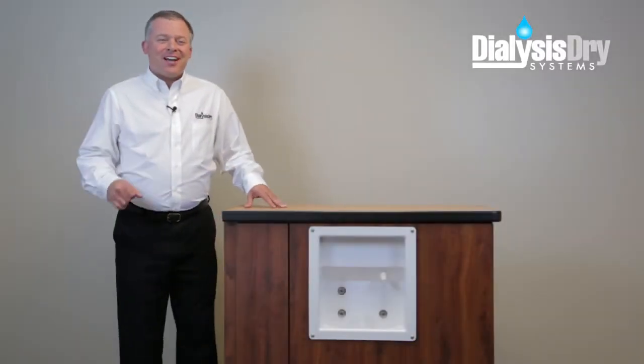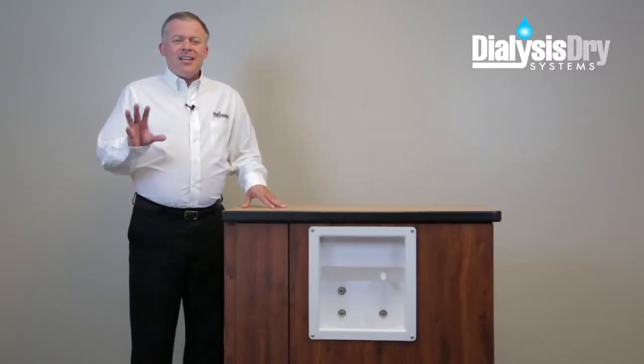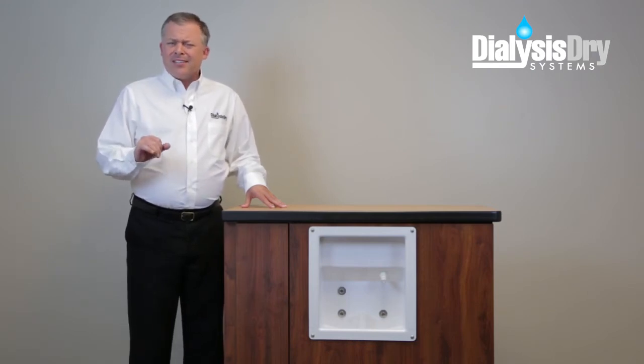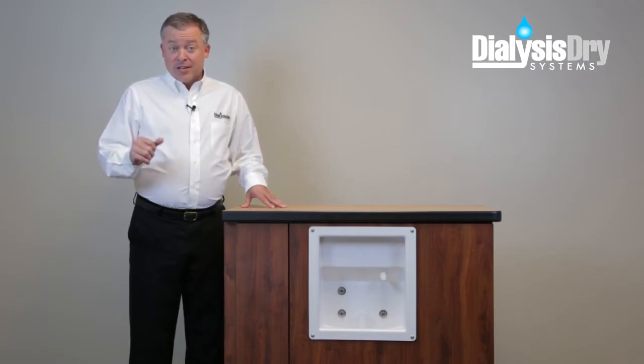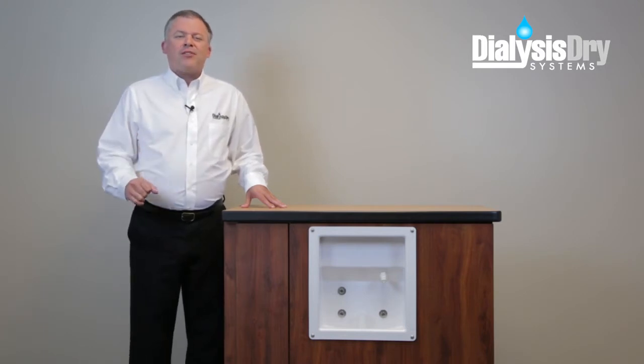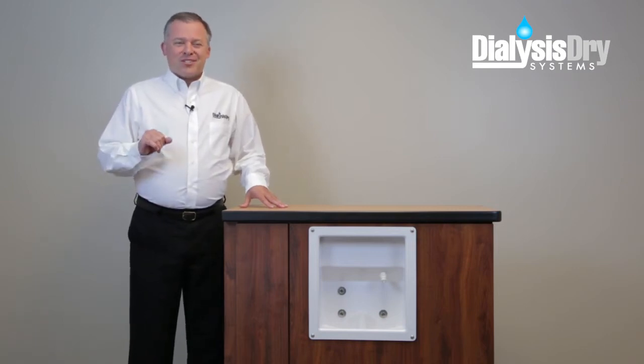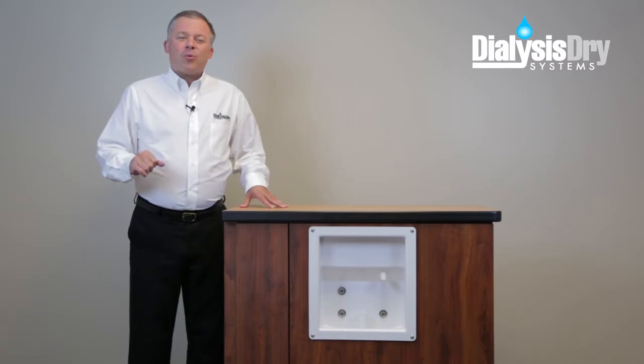Hi, I'm Ted with Dialysis Dry Systems. Today we're going to show you how to eliminate leaks from dialysis cabinets that can leave wet areas on the floor and unsanitary and hazardous conditions for the patients and staff within your center. It begins with the installation of the dialysis dry tray system. Let's take a look at how it works.